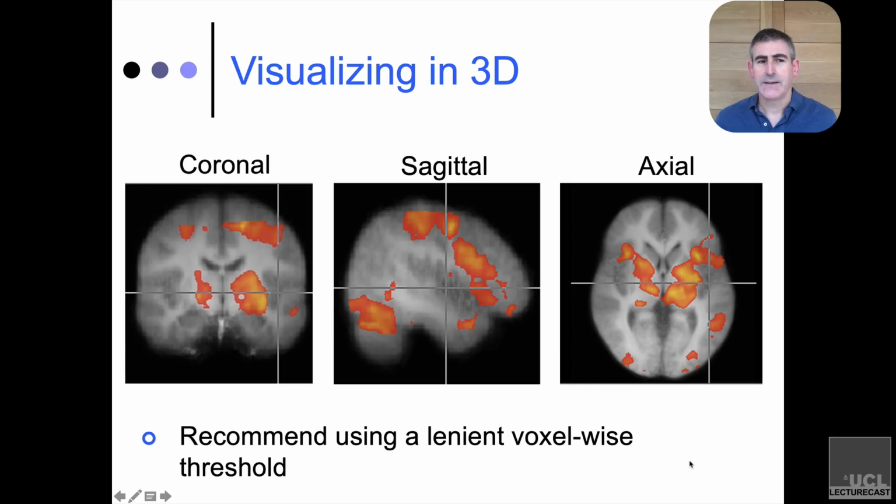It's something that I think gets ignored in functional imaging too much. I mean, everybody's doing it to some extent, but I think that a lot of us are looking for shortcuts in terms of understanding neuroanatomy. And while I understand that, I don't think that that's very helpful. I think that it's worth spending the time and effort to develop a pretty good understanding of the basic neuroanatomy, or in many cases, the more detailed neuroanatomy. And functional imaging offers you a lot of opportunity to do that.